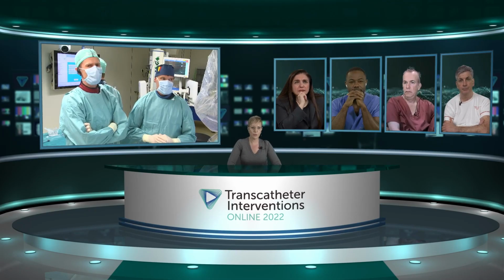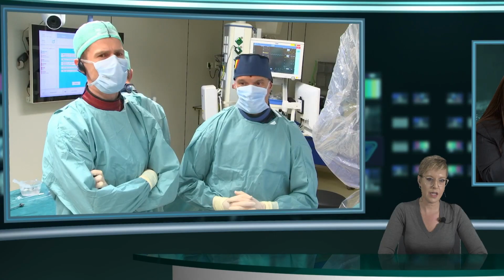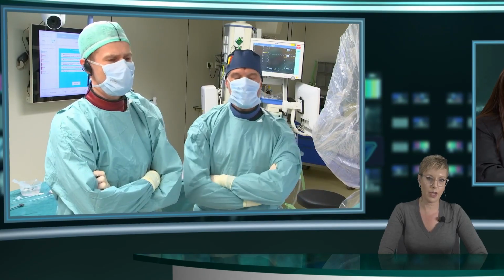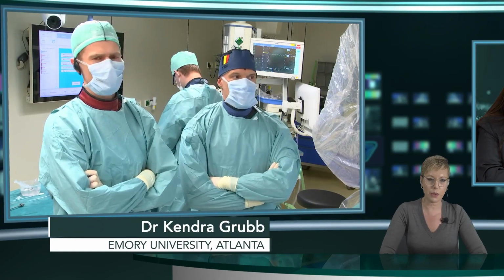Well, I think the one area that you haven't exhausted is, is he a transcarotid candidate? And of course, us being transcarotid first, we tend to really push our boundaries in that. So I know that's what I would do. But Roxana, what do you think?